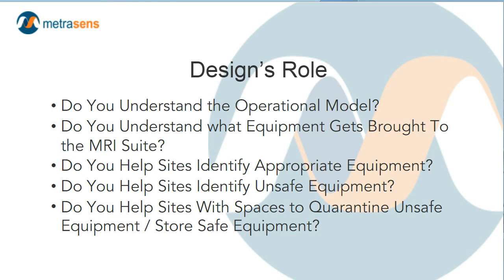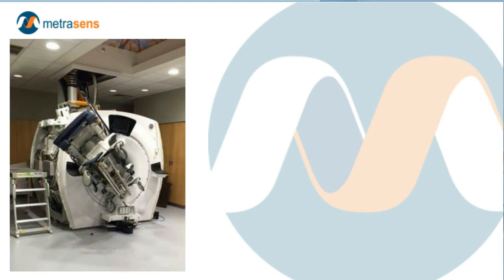Spaces with quarantines for unsafe material or equipment, and storage for safe equipment. These are all things that I believe designers can take a more proactive role in helping to make sure these facilities are appropriately planned, so that the function and the design of the space work hand in hand instead of fighting one another. And here I'm going to use a couple of photos of MRI accidents to help drive home some of these points.